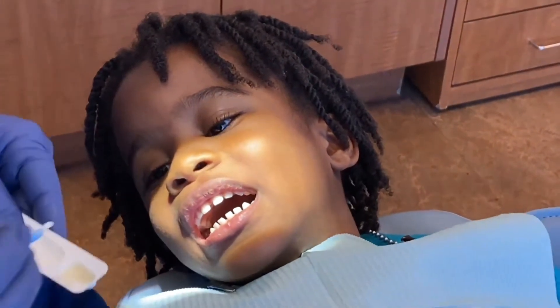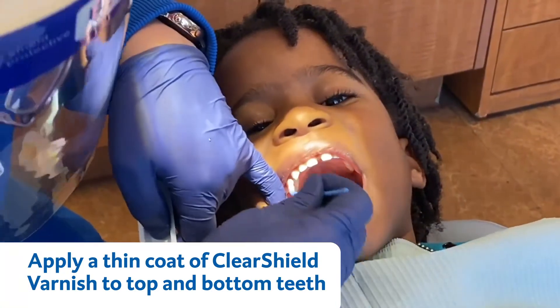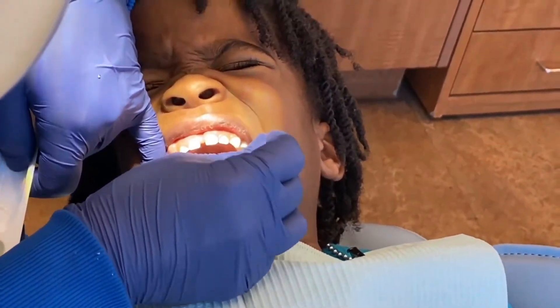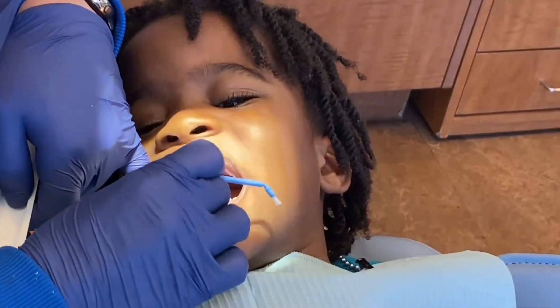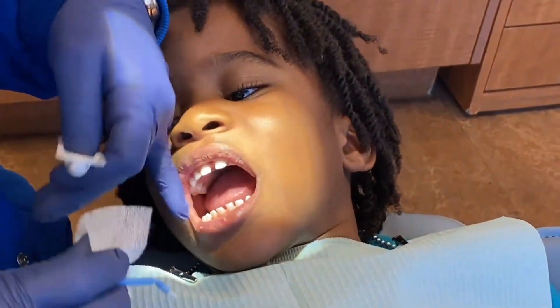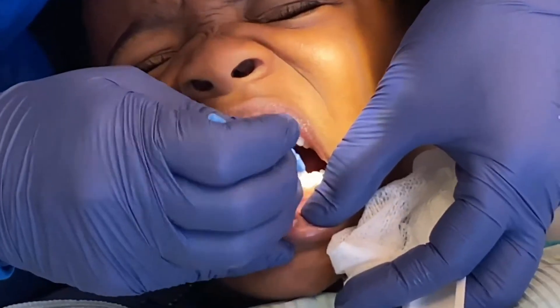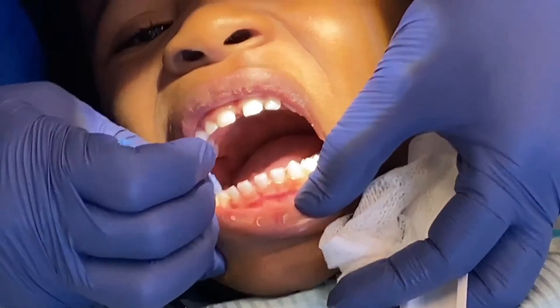Great job! Here comes the vitamins — what flavor do we have? We have caramel, oh yum! Good job — just open on the top with our brush and then we're gonna apply it on the bottom, all the way in the back, all the molars.